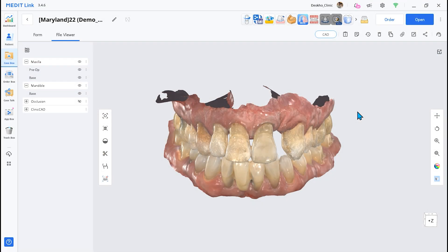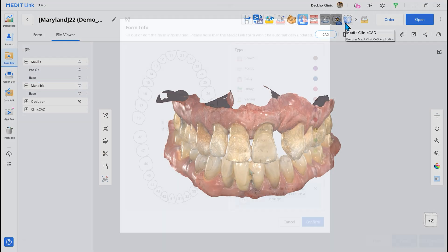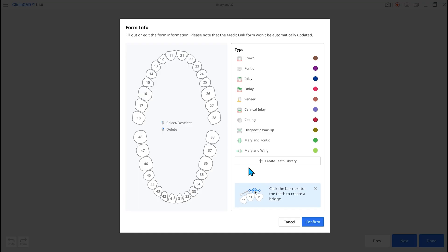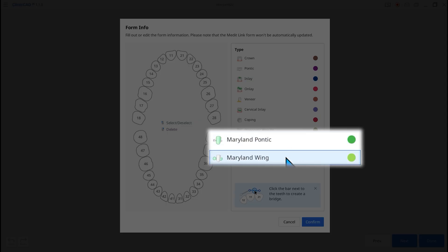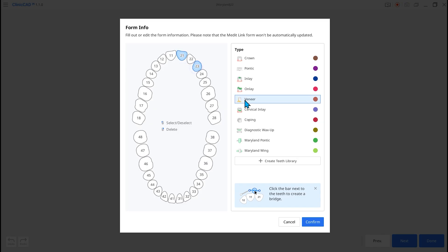Second, Maryland Bridge Support is added. To begin, select Maryland Pontic and Wing. The two components are automatically connected to a bridge.